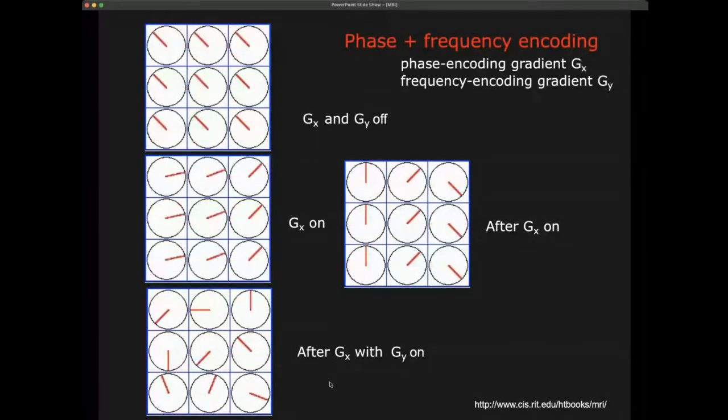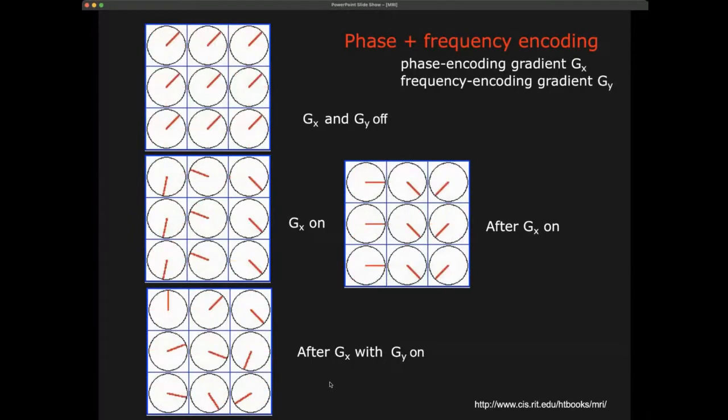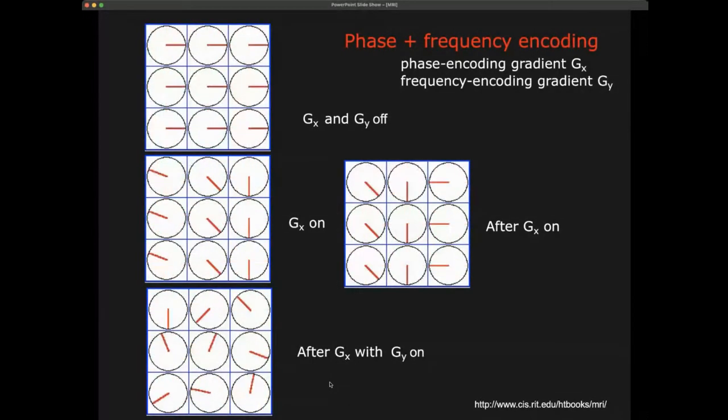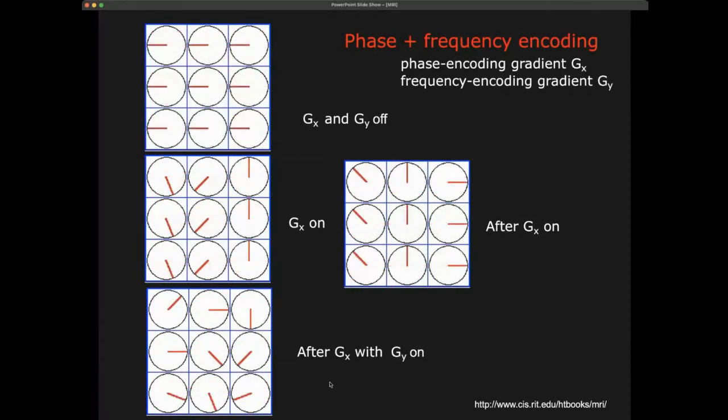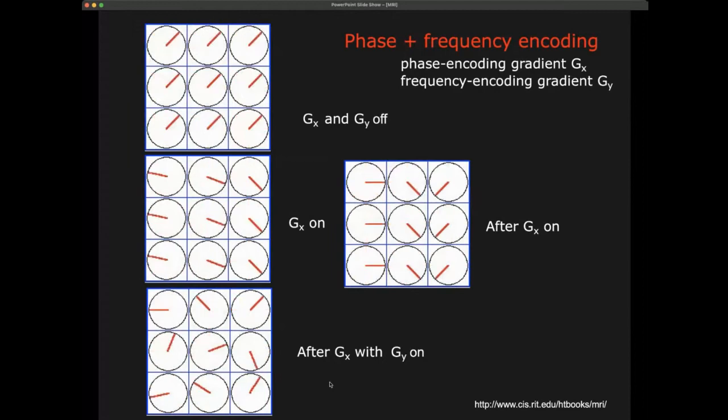Yes. One question. Why does each pixel, as it is in a different phase, not cancel out with the others, as it happens in the T2 model?